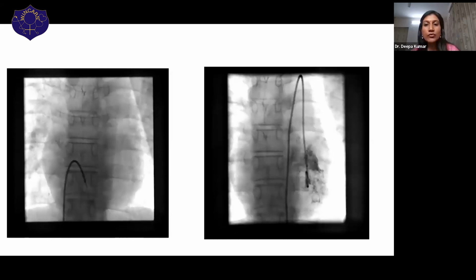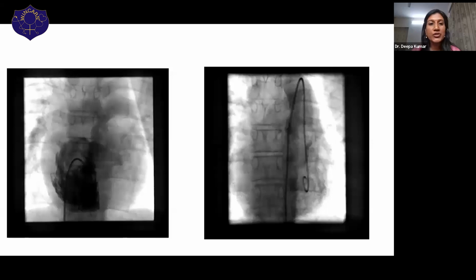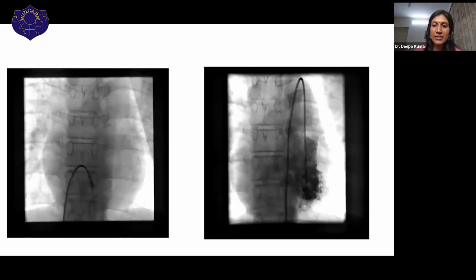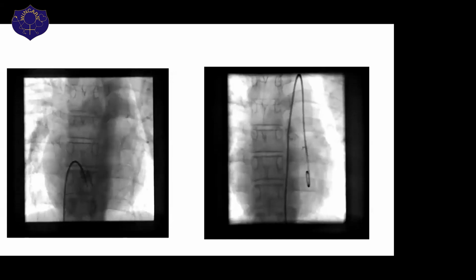So the view itself will give you a clue. We have taken the angiogram in AP view, which we hardly ever do to delineate any VSD or any ventricle. We have got quite a few right answers here. CCTGA is what most of them have written.